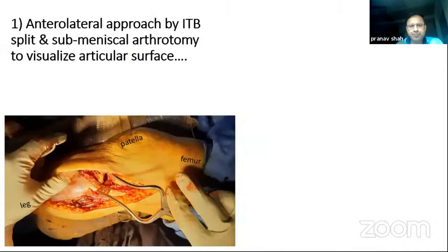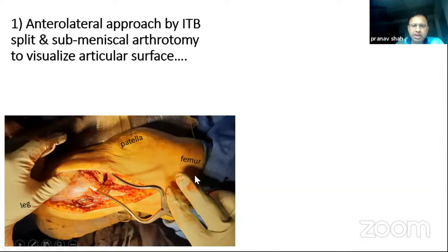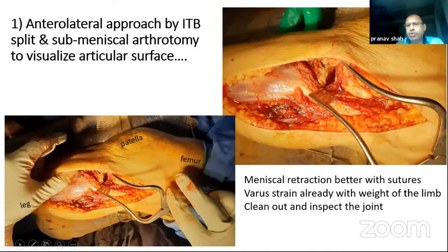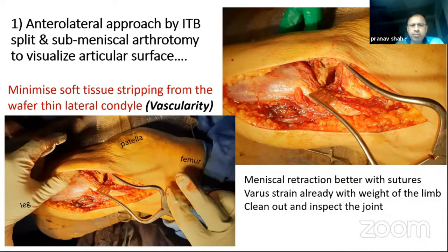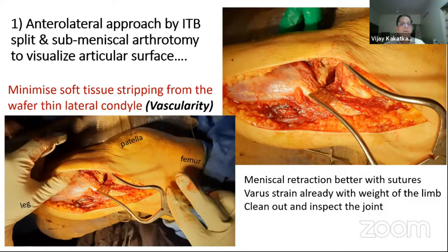There are two steps in the Frosch approach. The first step is the anterolateral window — the classic anterolateral approach done by splitting the iliotibial band, followed by a submeniscal arthrotomy to visualize the articular surface. You can use sutures to retract the meniscus for better visualization. With the bolster providing varus strain, you clean out the joint and inspect the articular surface. Importantly, the anterolateral condyle fragment is often a very thin wafer-like structure, so we should minimize soft tissue stripping to avoid avascular necrosis.